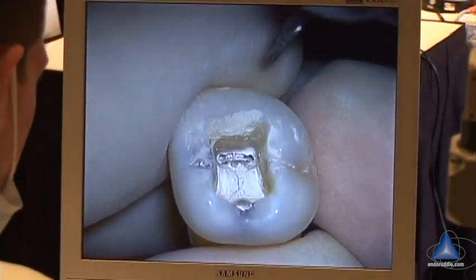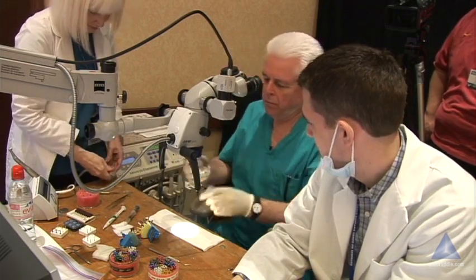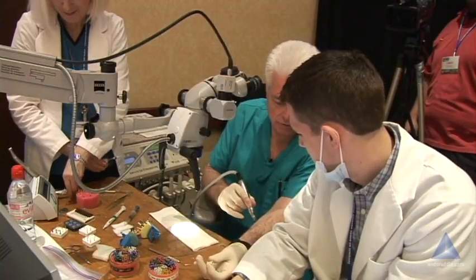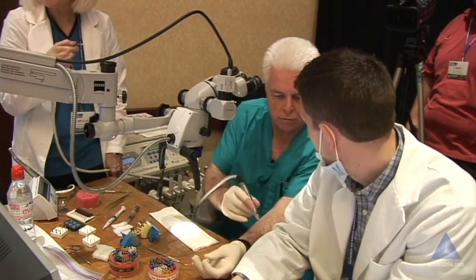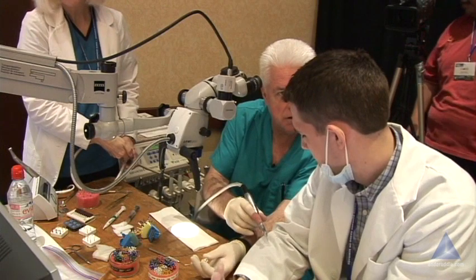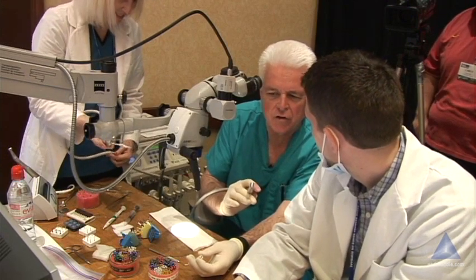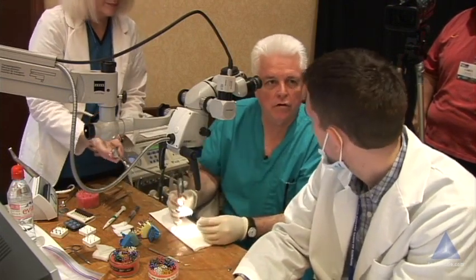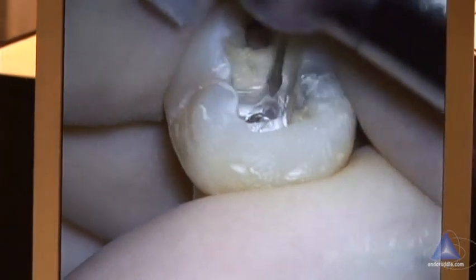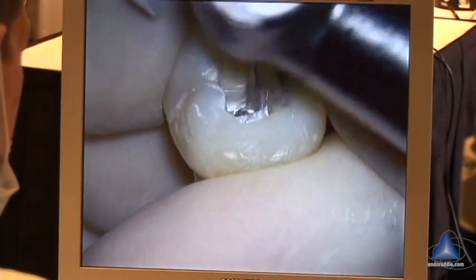Now I think I'm ready to go to work. Let's go with a GG3. I'm running about 500 to 750 RPM. What I want you to get is the pressure. 1,000 RPM is probably okay — I wouldn't quarrel with you, but the faster you spin, they start to grab, and I want you to have total control. Now I'm going to clean that wall up — now we have a more straight line. Didn't take high speed at all.